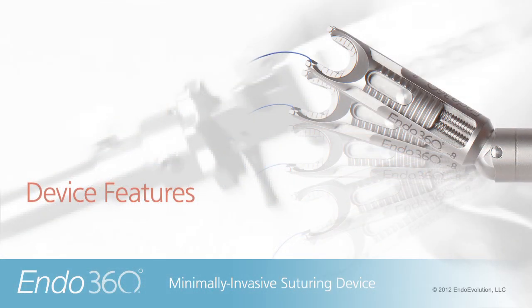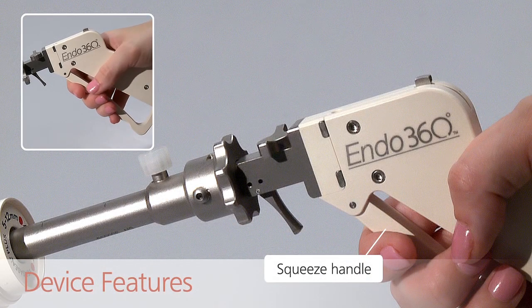The following features are located on the device handle. The handle is squeezed to drive the needle in order to place stitches and tie knots.